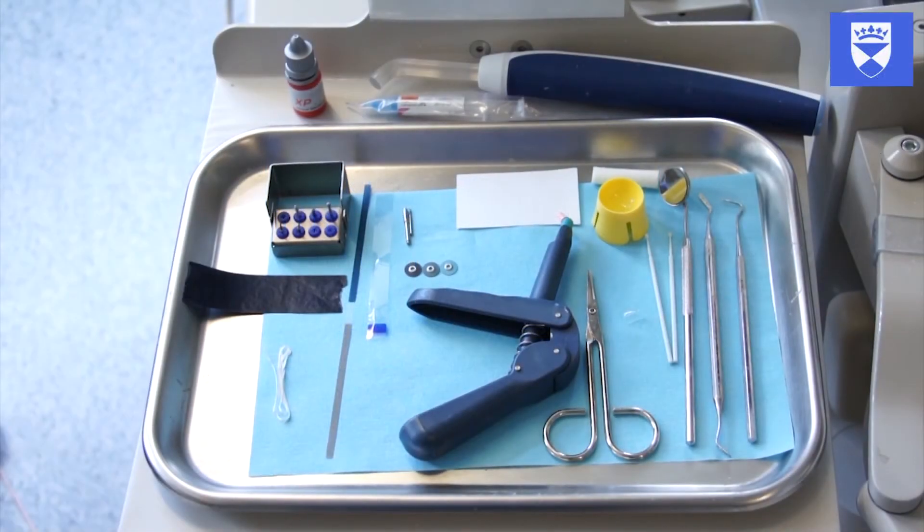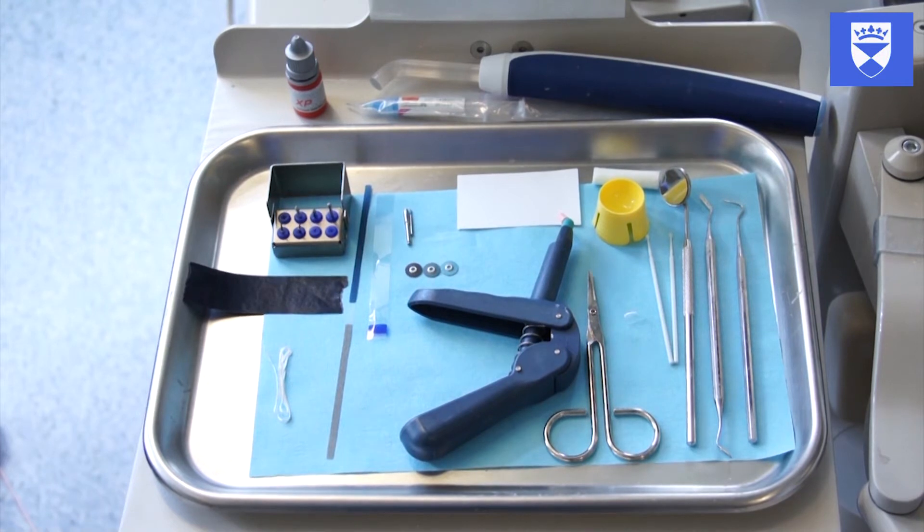This video demonstrates a predictable and reliable method of restoring an anterior permanent tooth using a composite filling material with the adjunct of a crown form or co-form tip. On the screen you can see a selection of materials and instruments that you may find useful in undertaking this procedure.